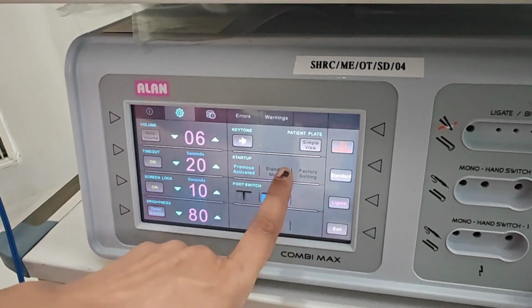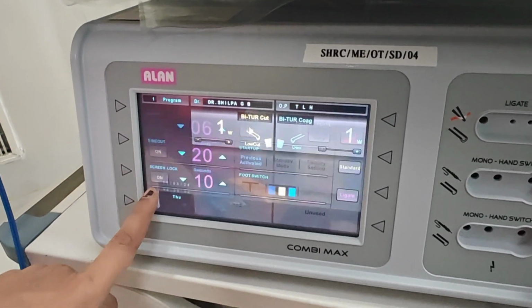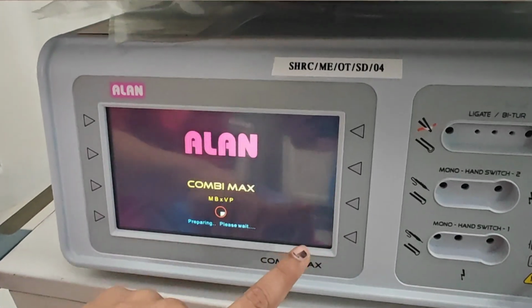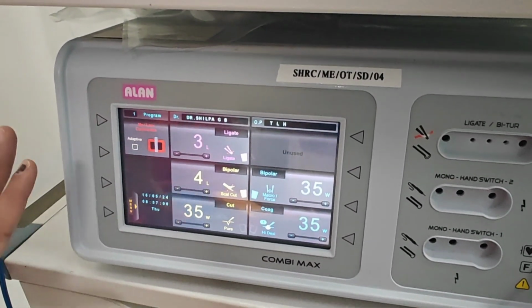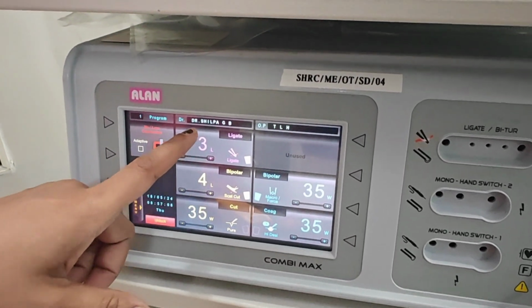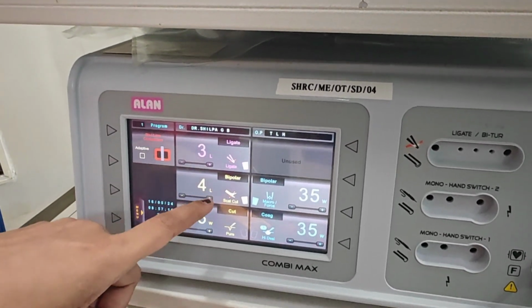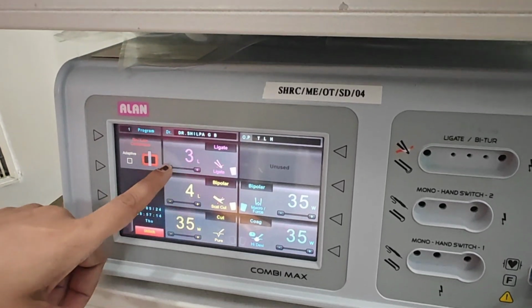If I go to the previous activated mode, then it is Dr. Shilpa G B TLH, which I regularly use for all the hysterectomies and myomectomies. So this is the standard screen which is seen if I have to use it for a hysterectomy, which again has a presetting which I have already done. There is a ligate mode, bipolar mode and a cut mode.